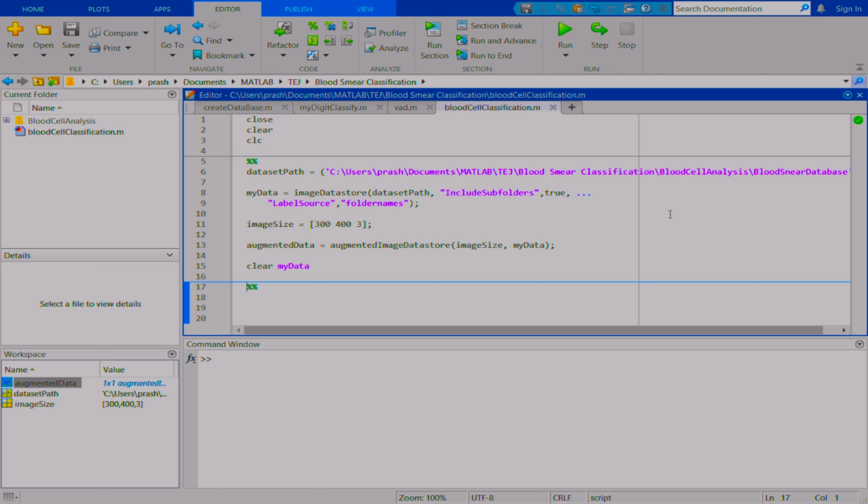That's all. Each of the folders, you simply put that category. No restriction on number. I may have just 10 to 15 in each of the classes. You simply add thousands to each class, and automatically it will take care. You don't have to make changes in any part of the code. Only increase the number of this data set, so that the data set becomes improved and there is more learning.